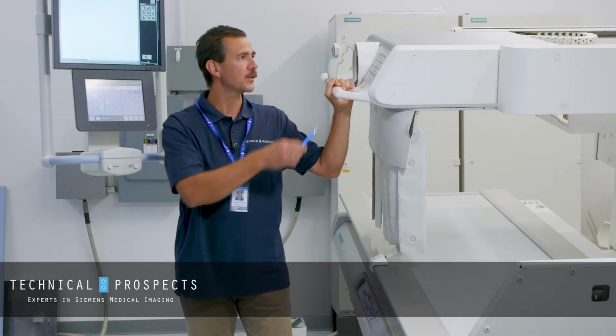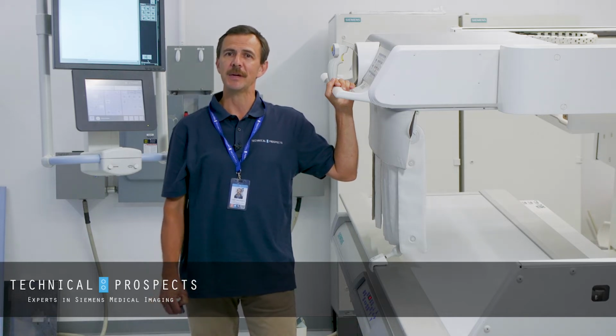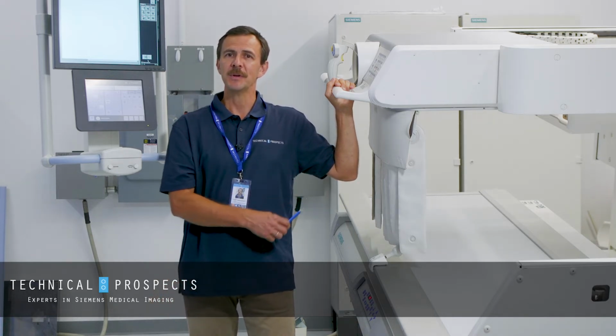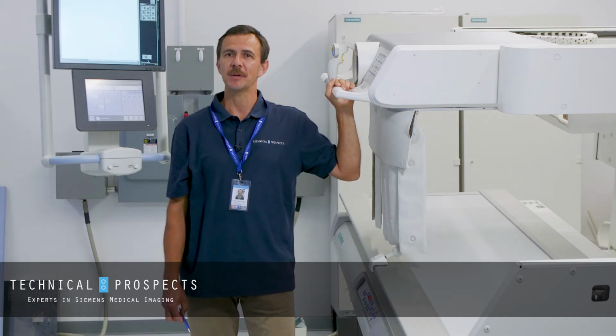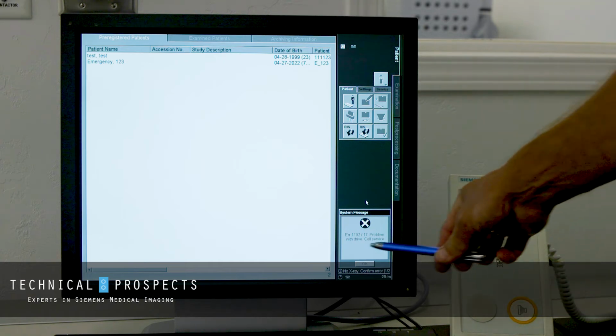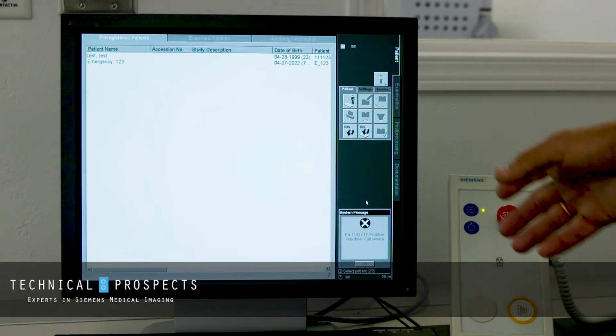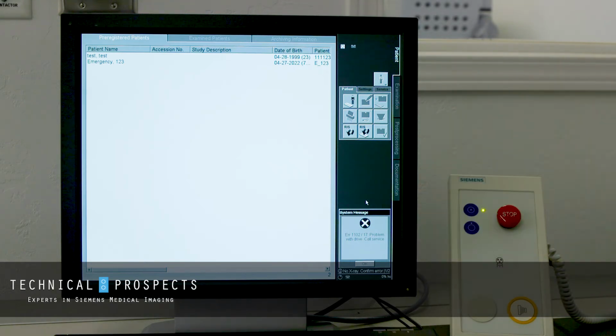Today's tech tip is about how to reset the red module in the Agile system during the patient exam. You will only reset the mechanical computer and make your system up and running again. Sometimes you have a problem with movement of the system, and to reset it, it's not always good to reset with the OK button, because the error will still be memorized in the red module.